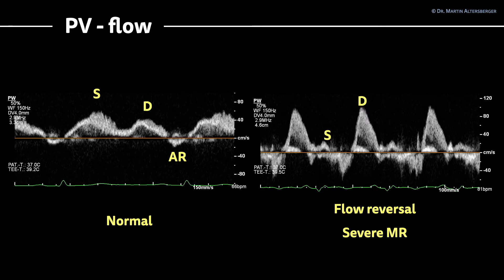To compare this with a pathological example: on the left-hand side you have the normal variant — you see nicely the AR time, the systolic and diastolic flow. On the right-hand side, you see a flow reversal in severe mitral regurgitation. The systolic signal is way smaller than the diastolic signal, which denotes it is pathological, and you have this systolic flow reversal in between the S and the D wave.